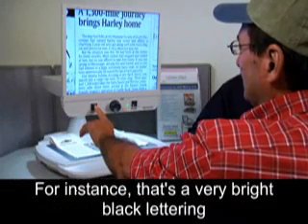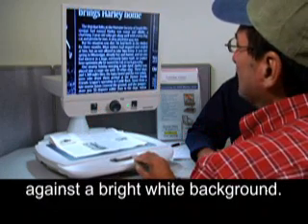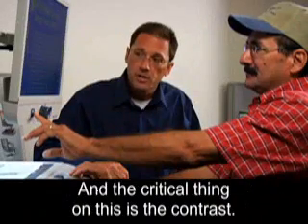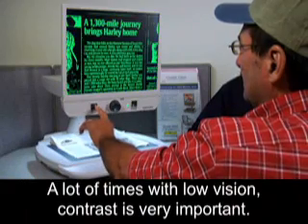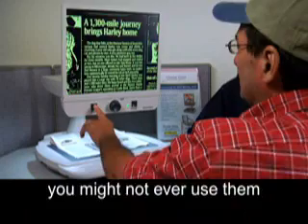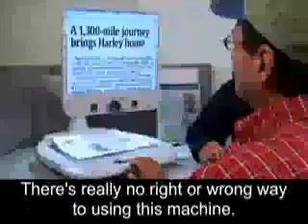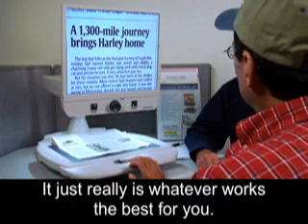For instance, that's very bright black lettering against a bright white background, and this here is white print against a black background. The critical thing is the contrast — a lot of times with low vision, contrast is very important. In some of those different backgrounds, you might not ever use them, or you might find one that works particularly well for you. There's really no right or wrong way to use this machine — it's whatever works the best for you.